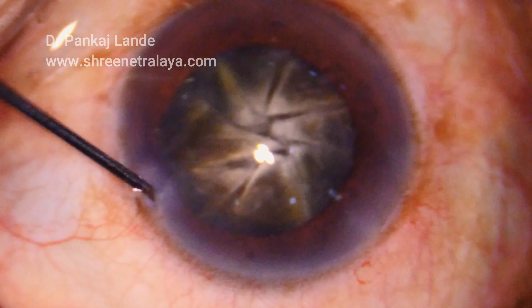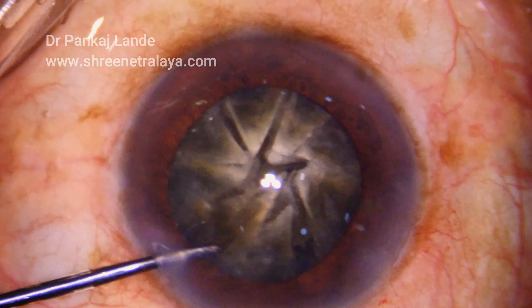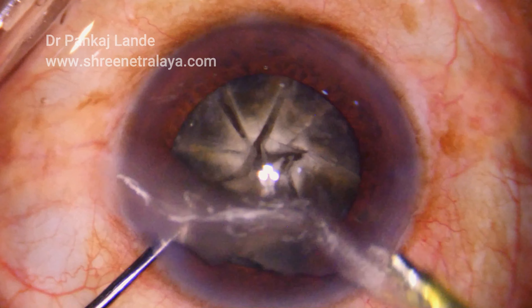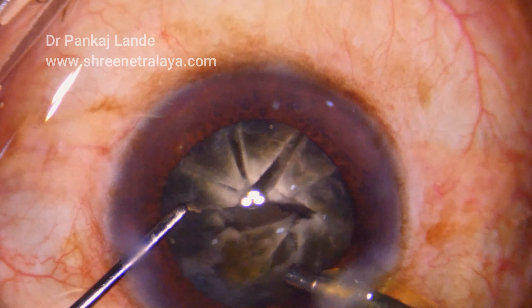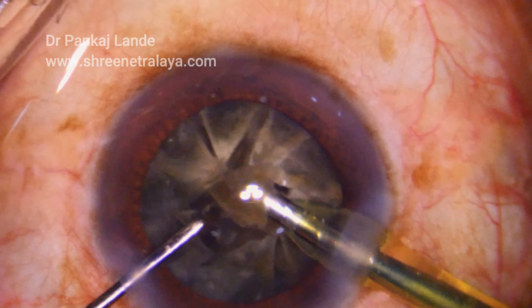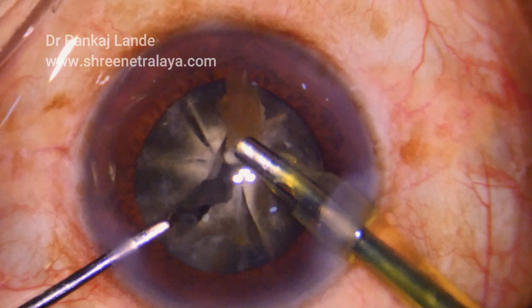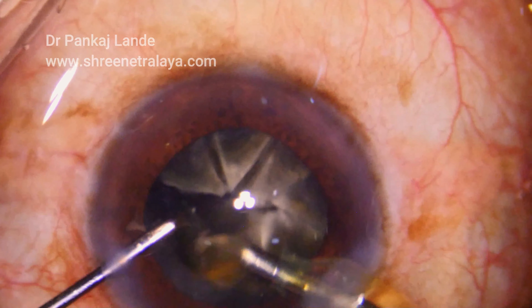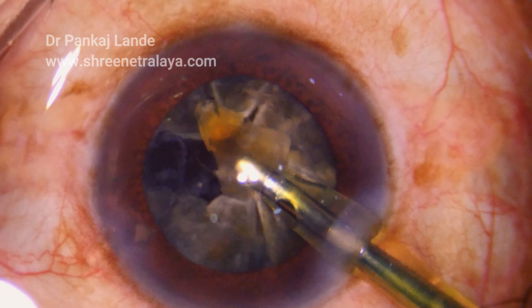As I start phacoemulsification, I can note that each and every piece is well separated till the posterior plate of the nucleus, which is the hardest part. I need not have a pre-chopper now, and having a slightly unstable anterior chamber, I decided to use a Sinski hook rather than a chopper, which is not needed at this point.